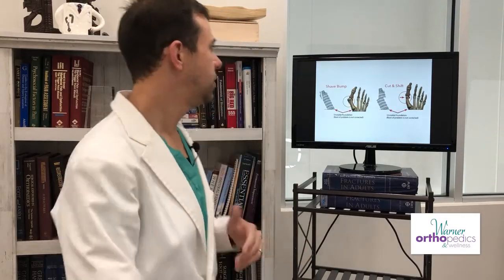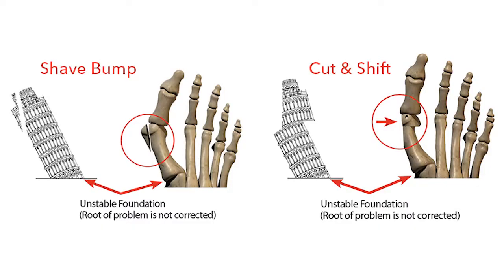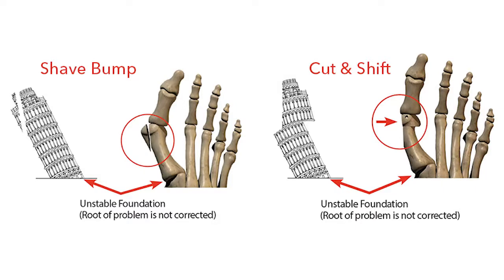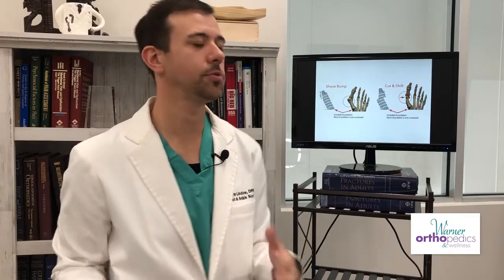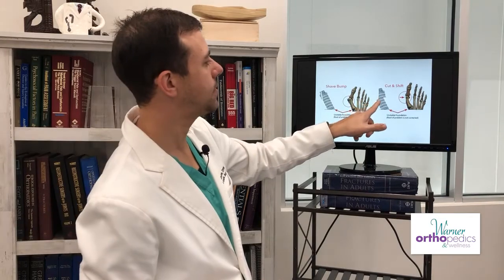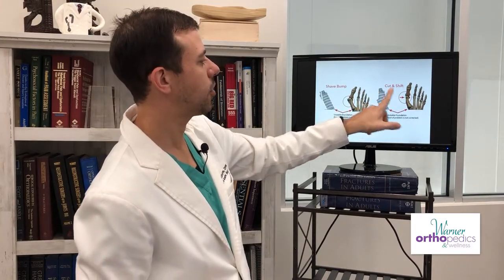deformity would be. So the typical procedures that are being done right now, one of them is simply shaving off the bump, so to speak, as well as the more common procedure, which is called the Austin bunionectomy or a first metatarsal osteotomy. And what happens with that is you actually make a cut in the first metatarsal and you shift the first metatarsal head over. Now, if you take a look at this from a structural standpoint, look at how they did it with the Leaning Tower of Pisa. What that does is that basically moves the head of the metatarsal over.